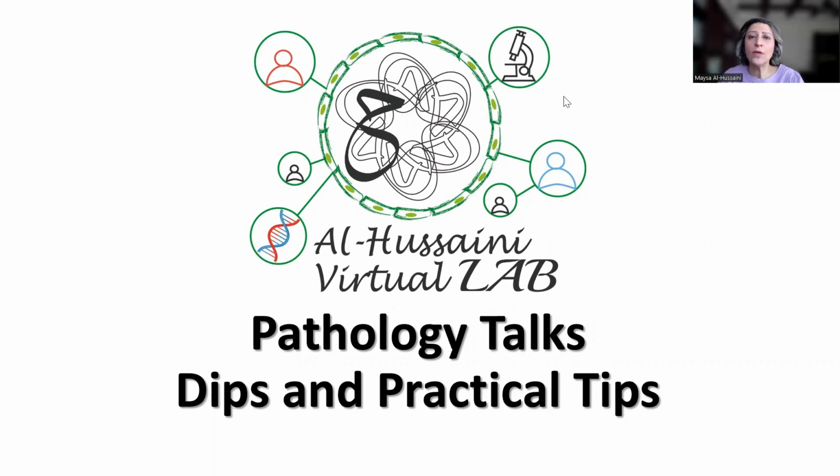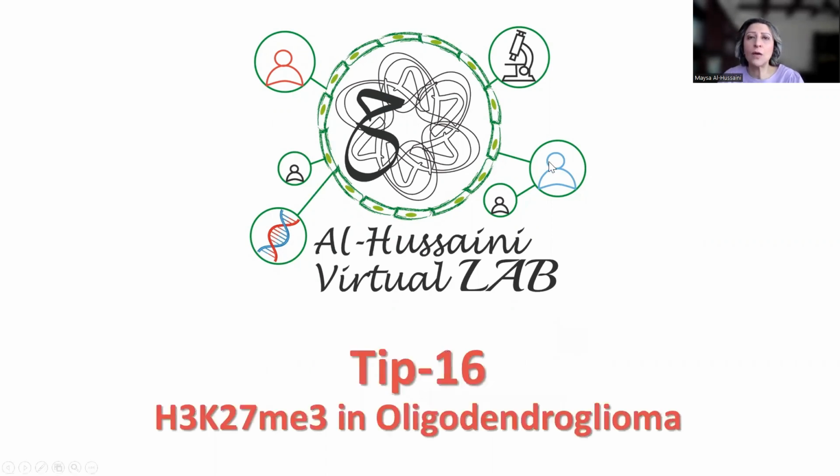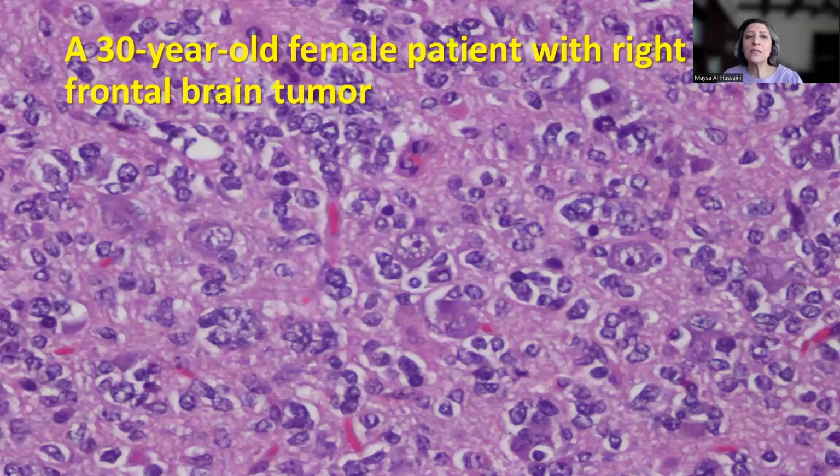Today, I'm going to also address another recently described utilization of the new immunohistochemical antibody, H3K27me3, this time in oligodendroglioma. So let's see how it works.